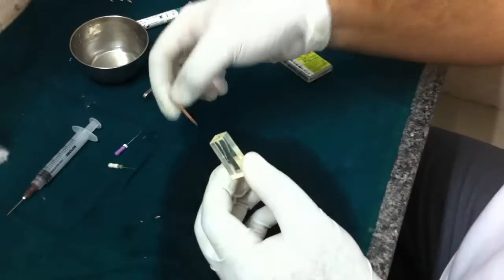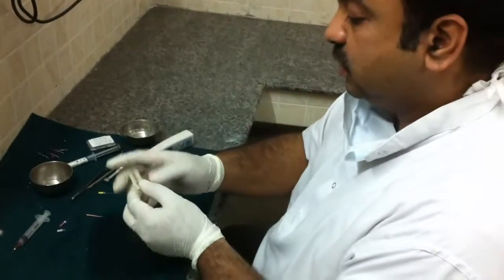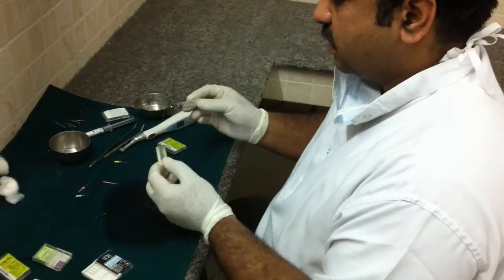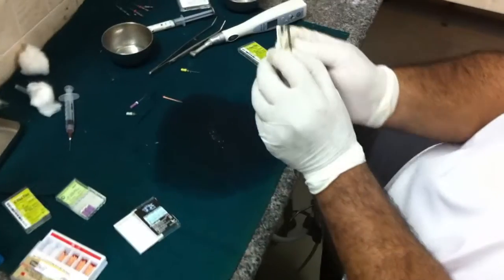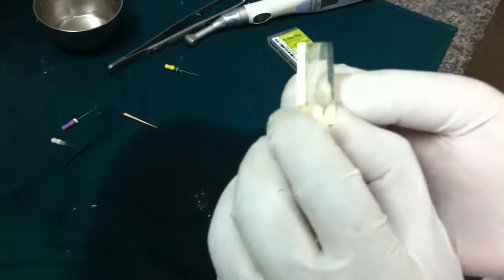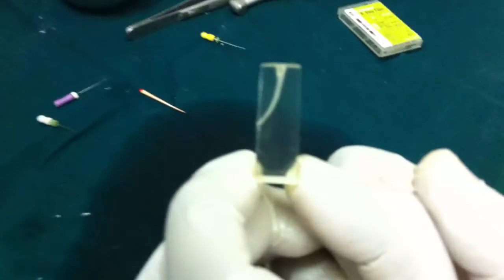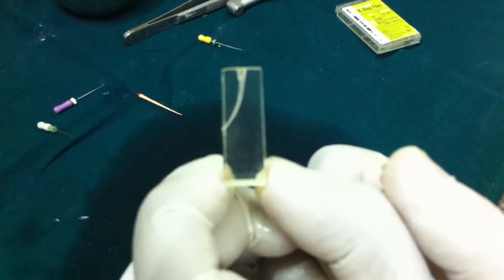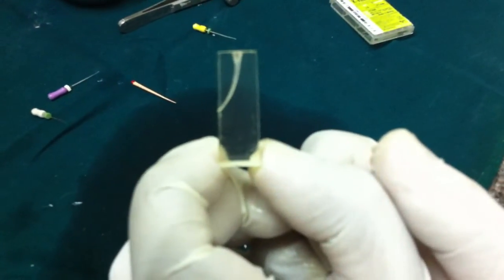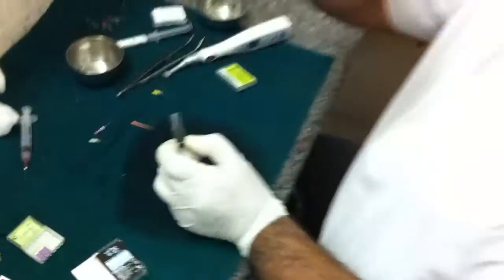And that completes the preparation. You can appreciate the nicely prepared tapered preparation of the acrylic block here. See the nicely prepared tapered preparation from the coronal to the apical. Okay, that completes. Thank you.